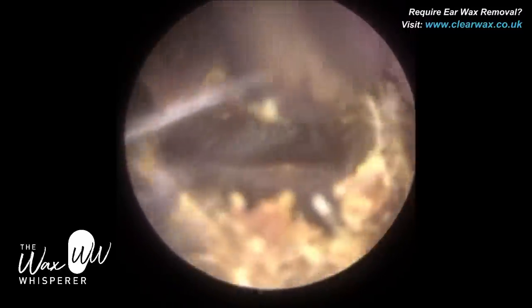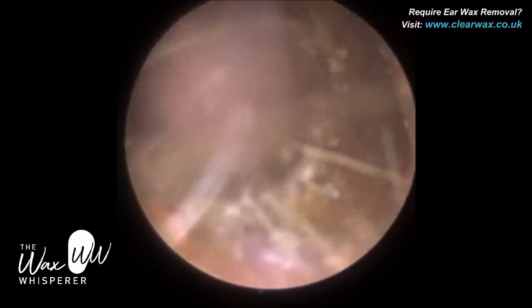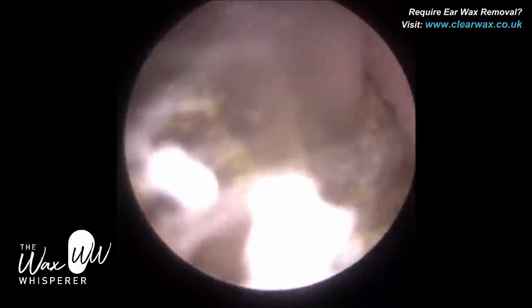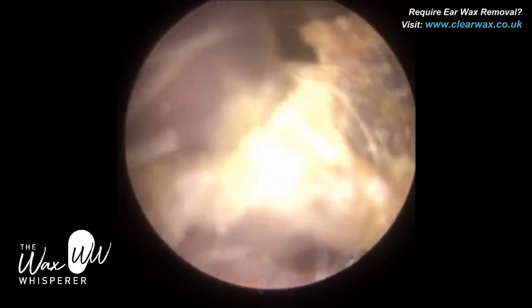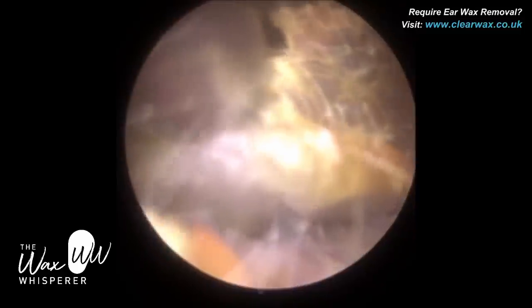Started to use the zonal suction probe. The wax, which is very lateral — we're right near the entrance here at the moment. We know that because of all the cilia, all the hairs. The hairs in the ear are only found in the outer third; that's where the hair follicles are found, in the cartilaginous portion. So this wax, which is very lateral, has a bit of a softer consistency.